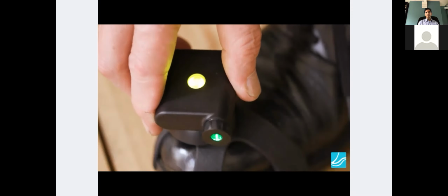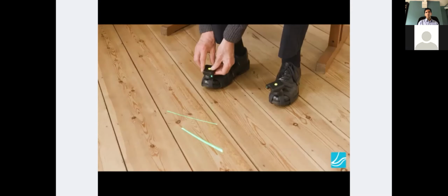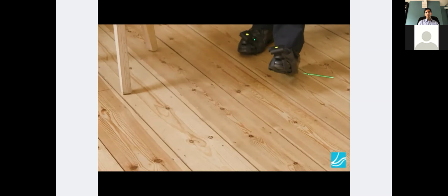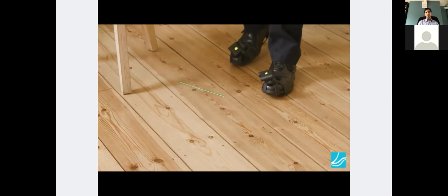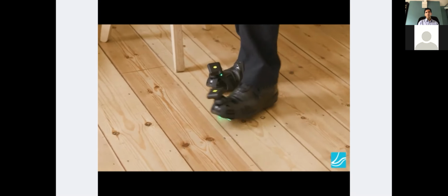Once the laser light is on, you can calibrate Pathfinder. To do so, you can rotate the unit on its base in all directions. You can also rotate the dial on the front of the unit to adjust the line angle. The ideal position for the laser line projection is at right angles in front of the opposing foot. The laser provides a line over which you should aim to step. You can adjust the line to suit your way of walking.